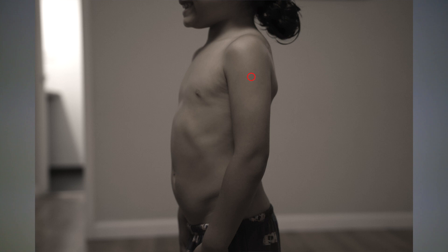If giving more than one injection, spread them 2.5 cm apart. For children 3 years to 10 years of age and up, inject into the deltoid muscle of the upper arm with a 5/8 or 1 inch needle. Two vaccines can be administered in one arm as long as they are 1 inch apart. Locate the top of the acromion process, go 2 inches below, and draw an imaginary upside-down triangle with the edge at the deltoid tuberosity — the injection site is the center of the deltoid.